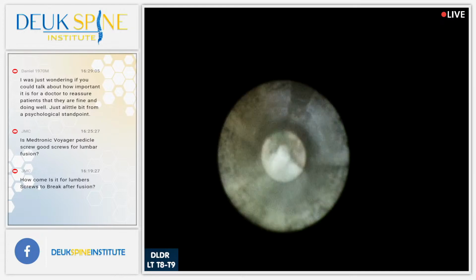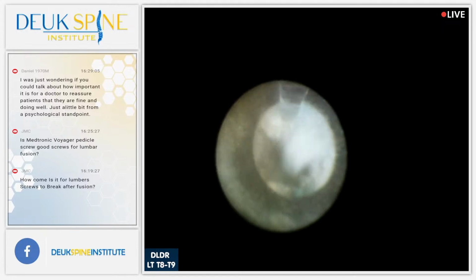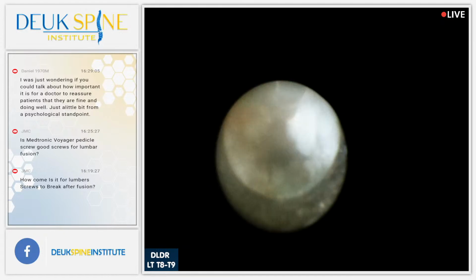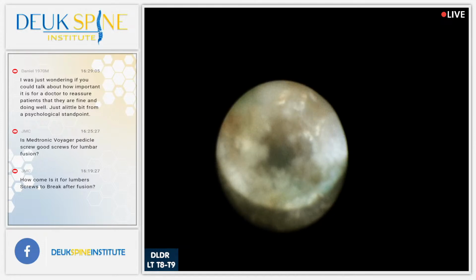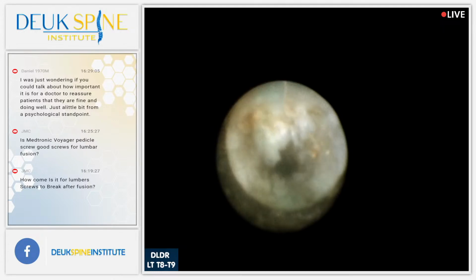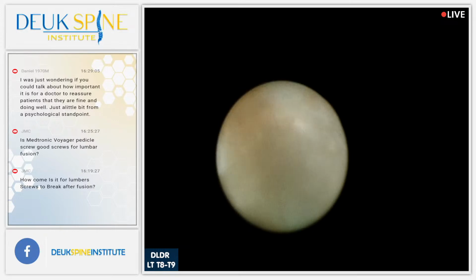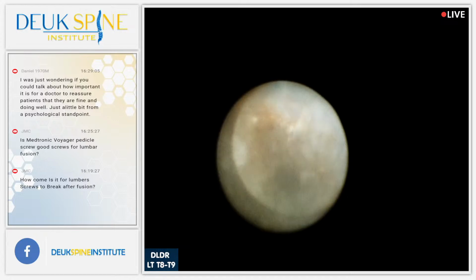Great question. I don't use the Medtronic Voyager pedicle screw system. I don't use Medtronic. I don't care for Medtronic personally. Not because their screws are bad, but I don't like their instruments. So when you're looking at instrumented spine fusions, there's 2 things you have to take into consideration. Number one, the quality of the implants, which is your cages, your screws that we're talking about, right? Properties of those implants. And the second issue is the instruments you use to put them in, okay?